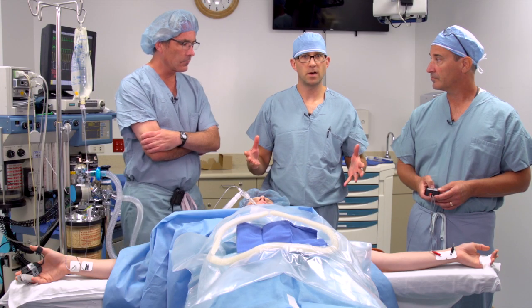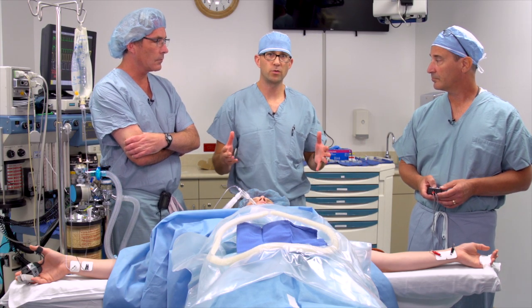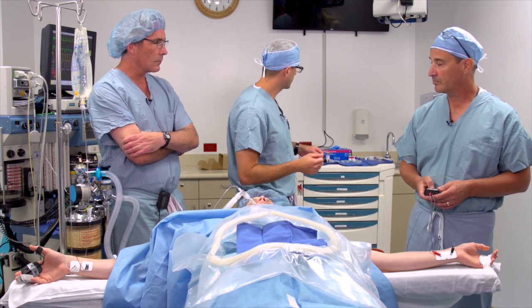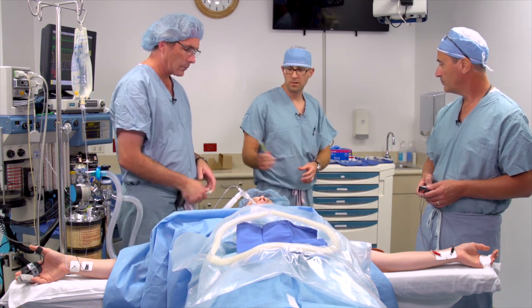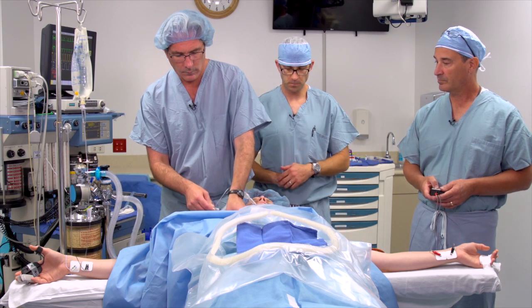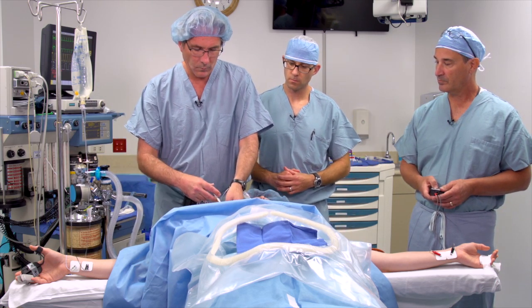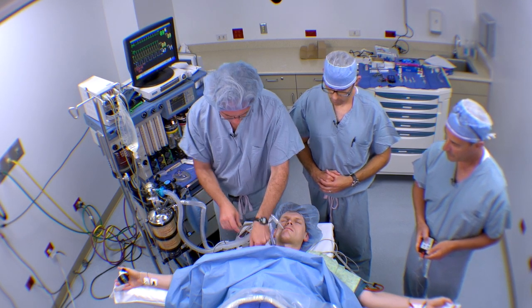In this scenario we've got a moderate level of block — two out of four twitches in the train of four. We're going to go ahead and reverse with neostigmine. Here's our neostigmine and glycopyrrolate mixture, and we've administered that.